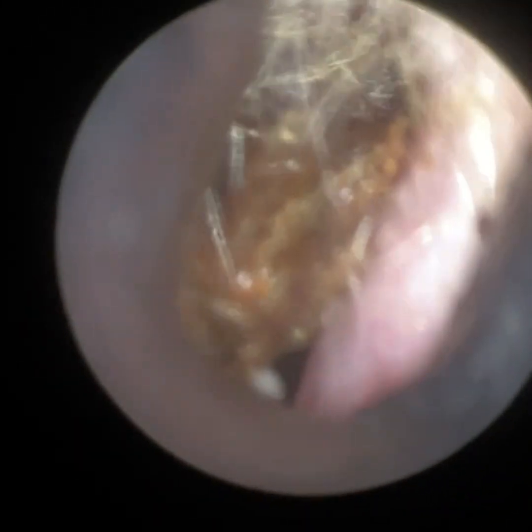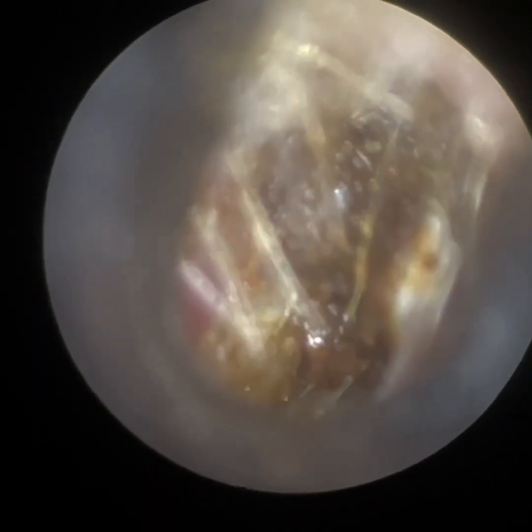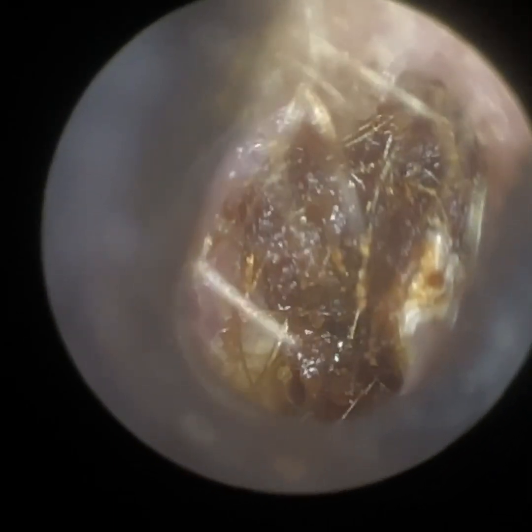So I'm just going to dilate the ear canal. I was very keen when developing the Waxscope to have a really small speculum size, like a 3.5mm, just for these particular cases — I think we would have struggled with a 4 or 4.25 to get in here. You can't really have it any smaller than a 3.5 because you're going to struggle to get the instrument into the ear through the speculum otherwise.